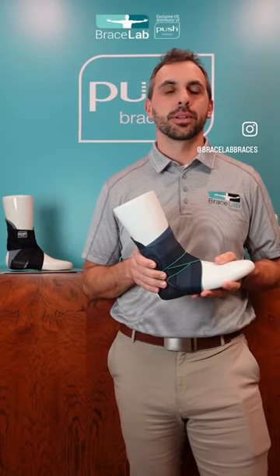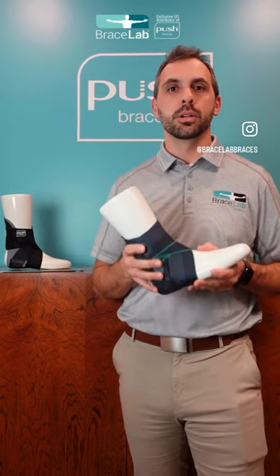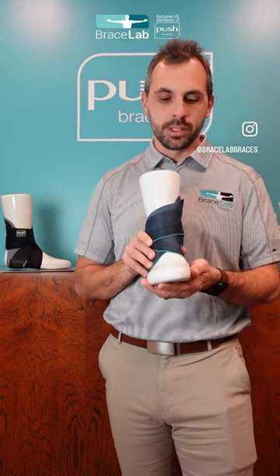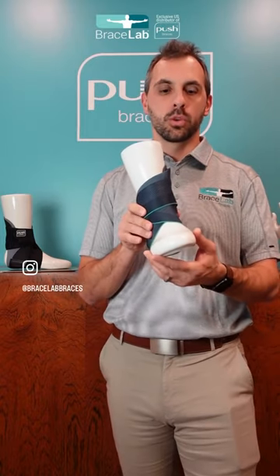Hi, my name is Jerry Dietz. I'm a physical therapist and the president of Bracelab. I am holding the new version of the Push Equi Ankle Brace. How this brace works is it prevents you from twisting your foot.